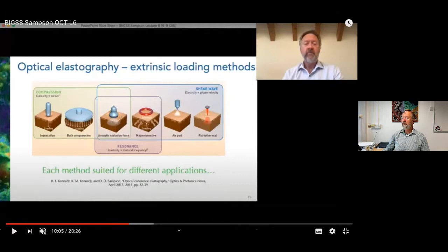If we have slide 11 from lecture 6, then Kai Nyhaus is asking about elastography. It shows an overview of the excitation methods. Are there attempts to use electric fields to induce biomechanical excitation? And what may be the challenges of using electric fields for biomechanical excitation?